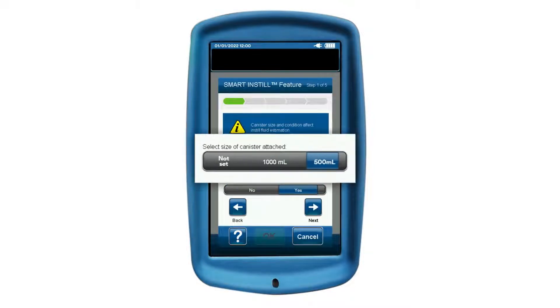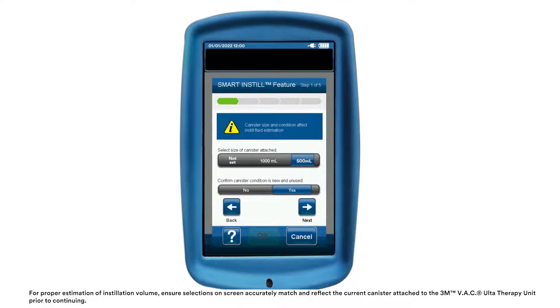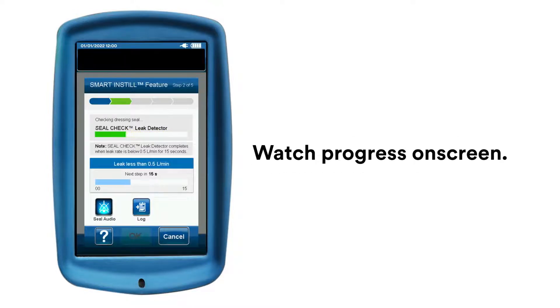Select the size of the canister attached to the unit. Then confirm you are using a new, unused canister, and press Next. The Smart Instill feature will automatically begin the 3M Seal Check feature, which will draw down the dressing and ensure there are no leaks. Once the Seal Check feature has determined that the target pressure has been achieved, the Smart Instill feature will begin to estimate the instillation volume.